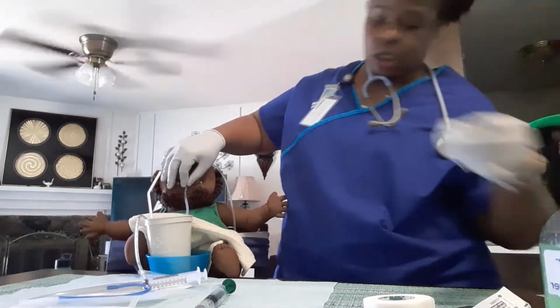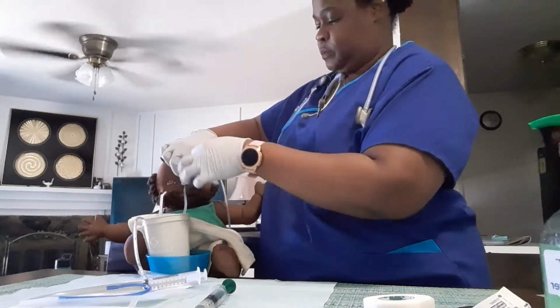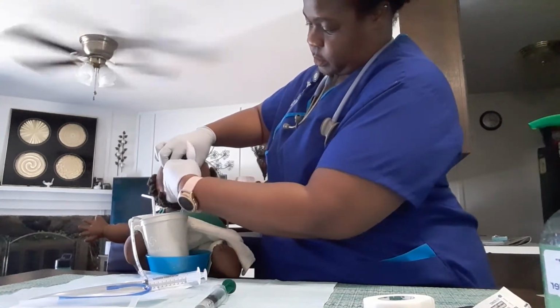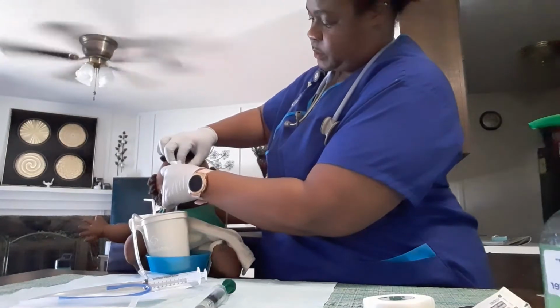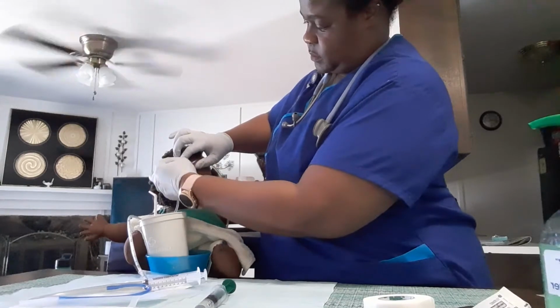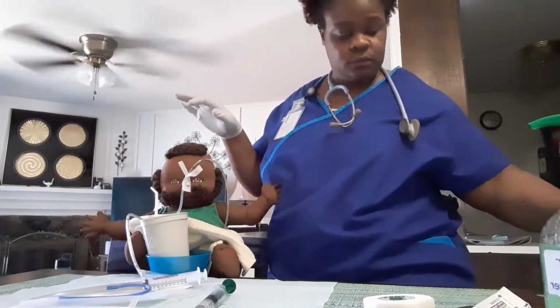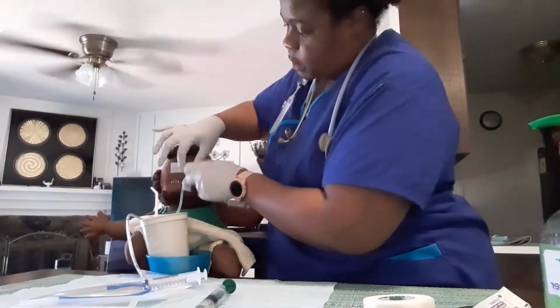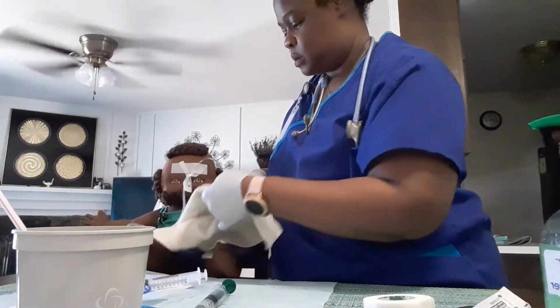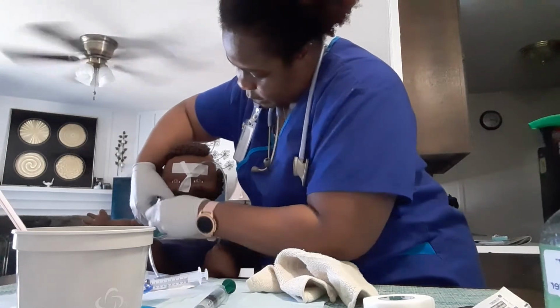I'm going to try to anchor the tubing as best I can, and then anchor across this way. I can take the cup away, and I'm going to secure it to the patient's gown with a clip.